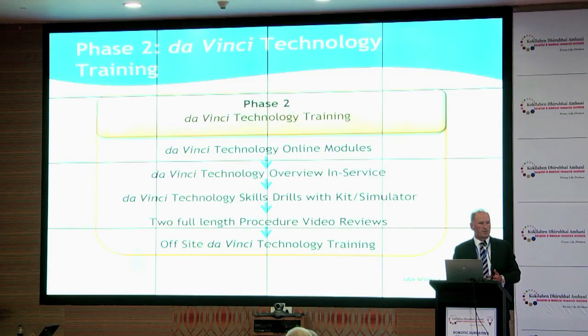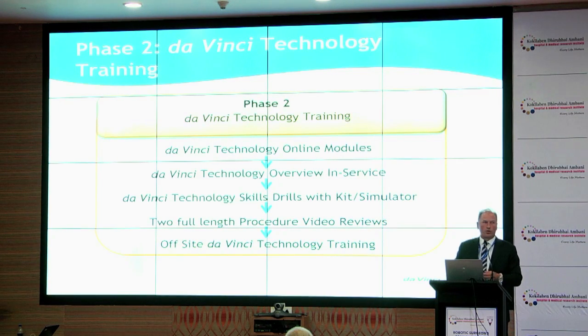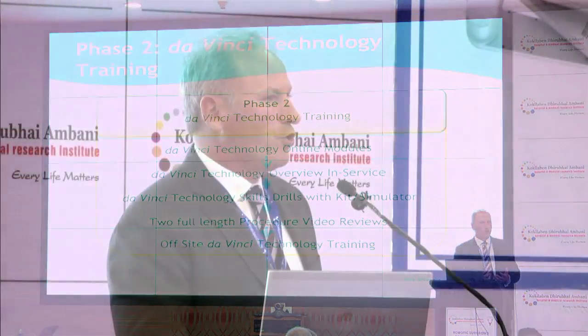So here, this is about online modules. That's how we start. And then we also conduct the in-service. This is a time where you get one-on-one and you learn every aspect of the 3 components of the Da Vinci system. Then also simulation, or dry skills if you don't have access to a simulator. Extremely important, preparing you really for the last item here, which is the Da Vinci training, the 8-hour training lab.